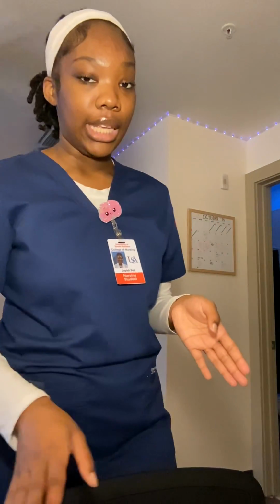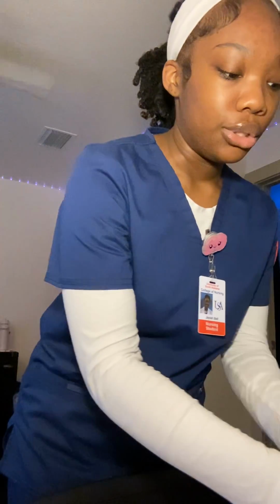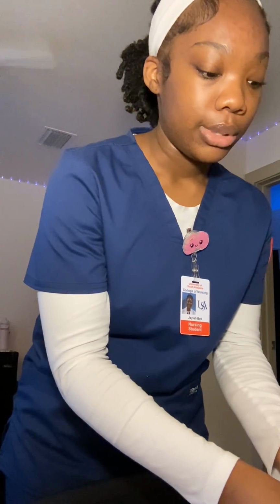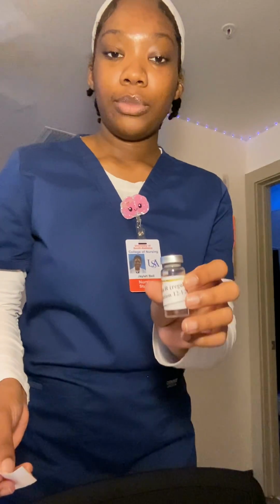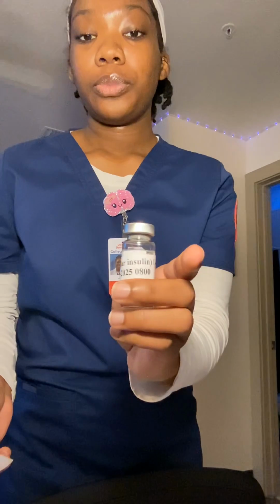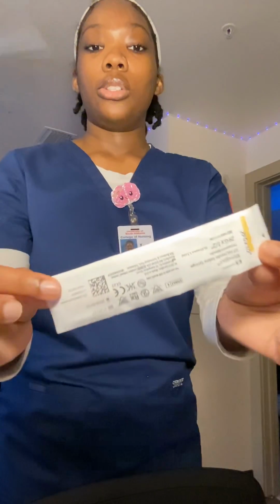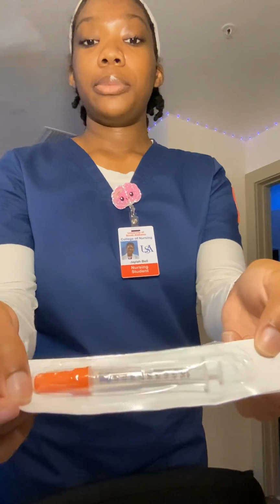Now I'm just going to go ahead and draw back those 10 units of insulin in my syringe. I'm going to do hand hygiene one more time just to be safe. First, I'm going to start by cleaning my vial with an alcohol pad. Again, this is the correct medication. Alright, I'm going to go ahead and show you this is also the correct syringe and needle.